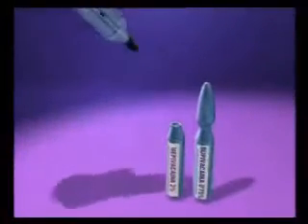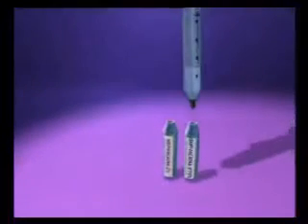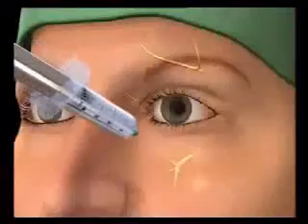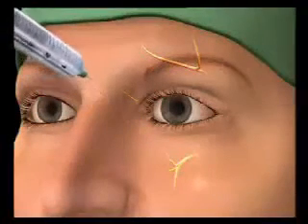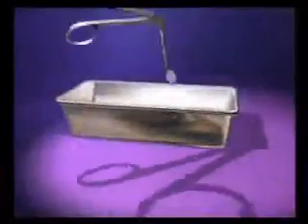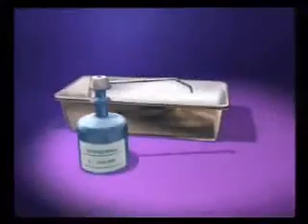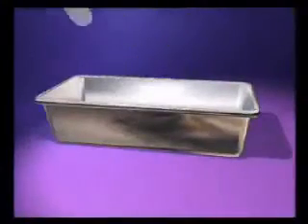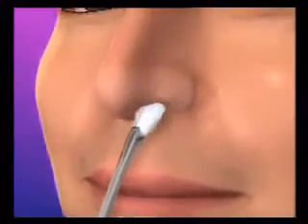The local anesthesia, a mixture of 1.5 milliliters of mepivacaine 2% and 1.5 milliliters of bupivacaine 0.75%, is infiltrated in the nasociliary area, blocking the infraorbital and infratrochleal nerve with 1 milliliter of anesthesia in each area. For the topical anesthesia, a cotton swab is impregnated with a mixture of tetracaine 1% and epinephrine 1/100,000 and placed in the nasal fossa about 15 minutes before surgery.